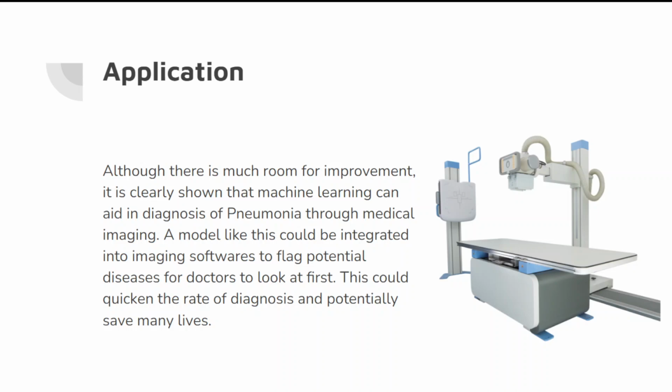Now, to apply this research, there's a lot of room for improvement. There's other techniques I could continue using. I could try augmenting the data a bit more. I could manipulate the parameters or add some more convolutional layers, but it's clearly shown that the model could play a part in assisting the diagnosis of pneumonia through medical imaging.